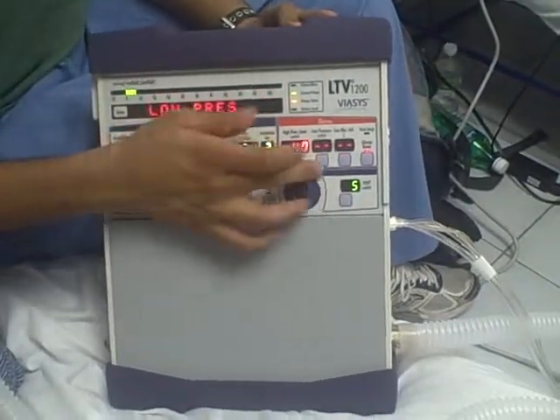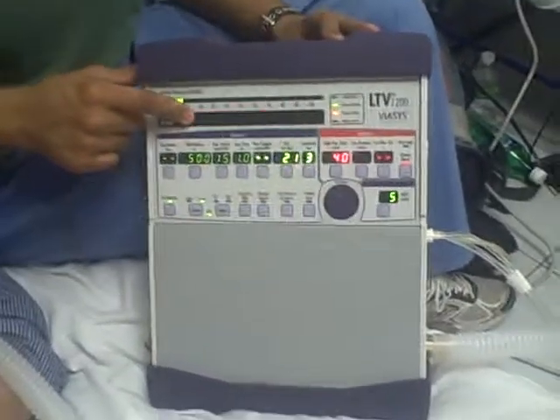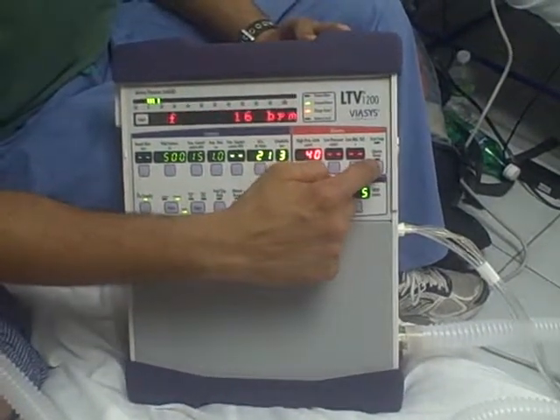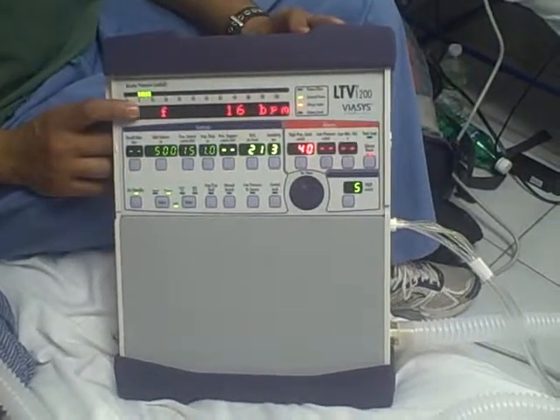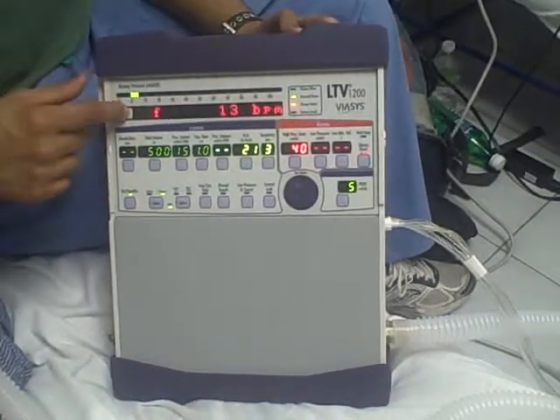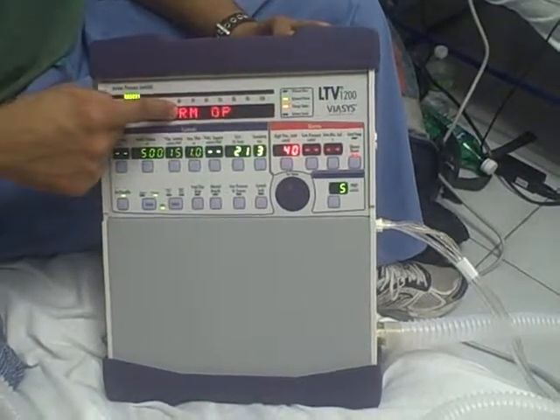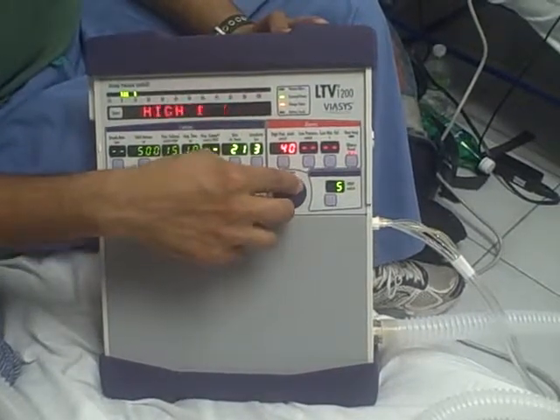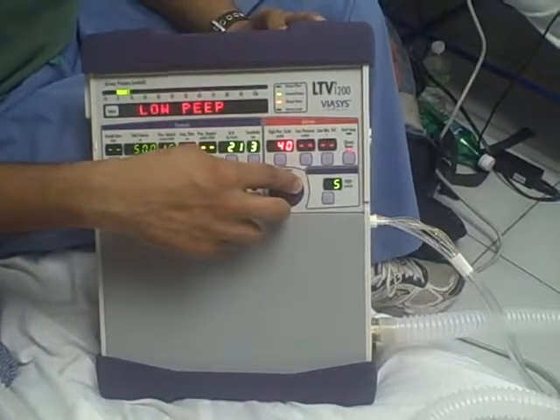These are the 3 most important alarms and the most commonly alarming buttons. You notice that the low pressure alarm continues to blink after I'm finished. If you want to get rid of that alarm, you just continue to hit silence reset until it goes away. There are some more advanced alarms which you can read your manual to find out more about. Suffice to say, the easiest way to get there is to hold the select button, and when you hold it for long enough, you see an alarm options box, which you can hit select on, and you can get to other alarms that might be bothering you depending on your situation, particularly in patients who are ventilated.